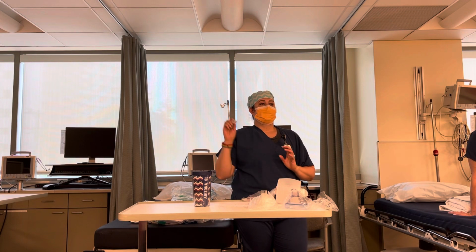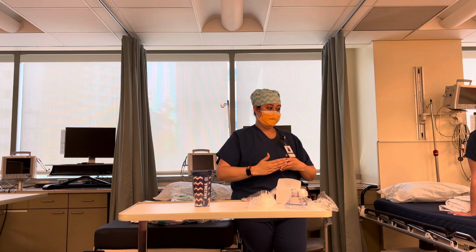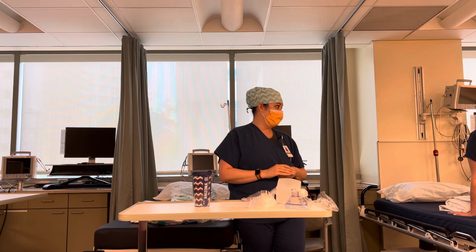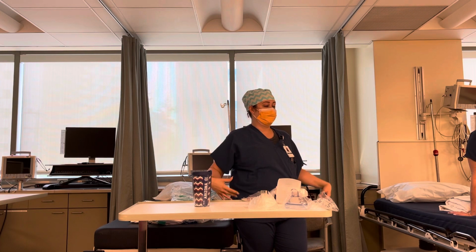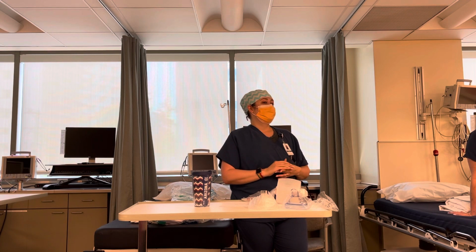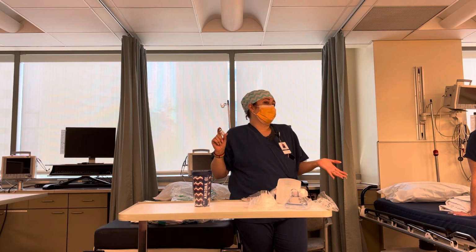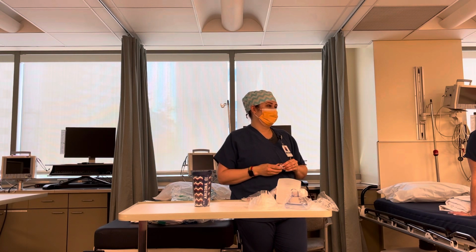So it's 5 cc's. For an intubating dose, you would give pretty much the whole thing. And then there's going to be no effort. They're 100% paralyzed, their entire body. So you have to breathe for them now. What do we have? Does this just wear off on its own, or do we need a medicine to reverse it?